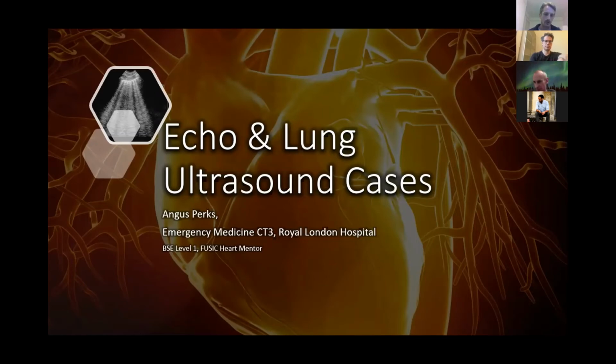And of course, you've got to wonder when we're taking on a new ultrasound modality, what does this offer us, and how do we incorporate it into practice? So when I speak to my friends who are respiratory registrars and so on, they're not very interested in lung ultrasound apart from pleural, because they just CT everybody, because most of their patients are already up on the ward, they've been stabilized and so on, so they can get a CT and that's fine. But for us, lung gives us the ability to do it very quickly at the bedside and to track changes over time, and it's much better than chest x-ray.